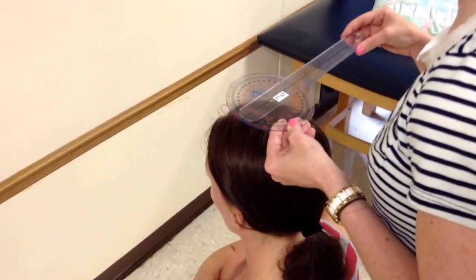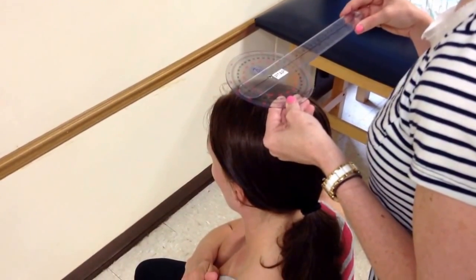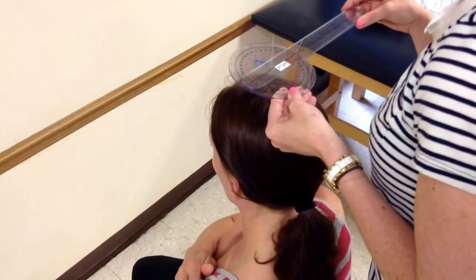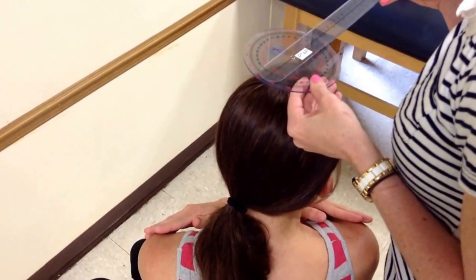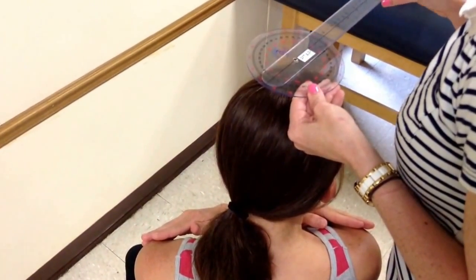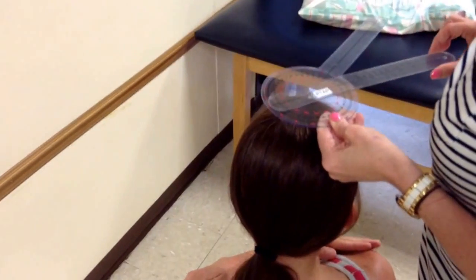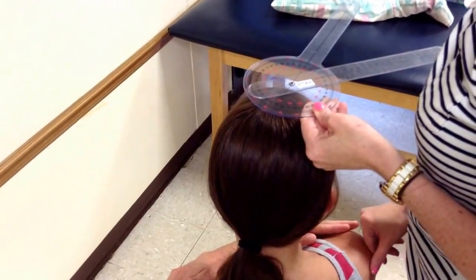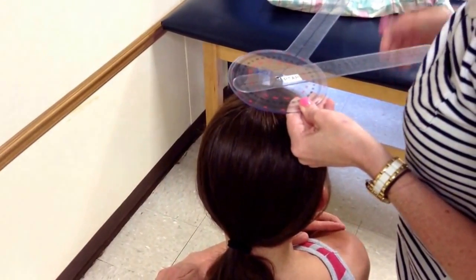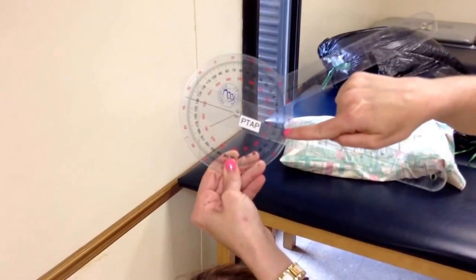My instructions to the patient are: I want you to turn your whole body and look over to the right side. If she compensates with too much cervical motion, it really doesn't matter because my goniometer alignment has taken that into account. I move my moving arm so that it is parallel with the imaginary line connecting the two acromion processes. My moving arm started here and came down to about 41 degrees.